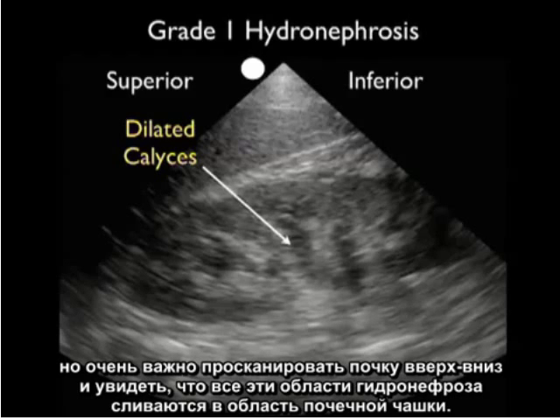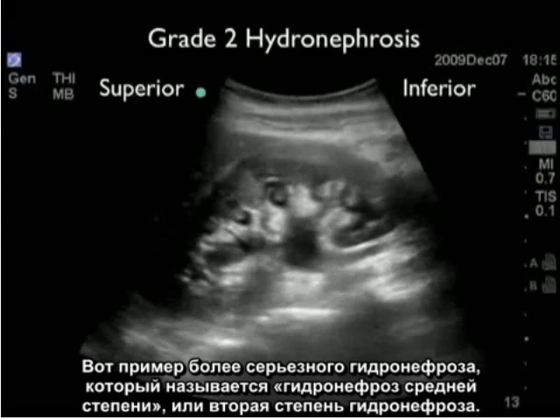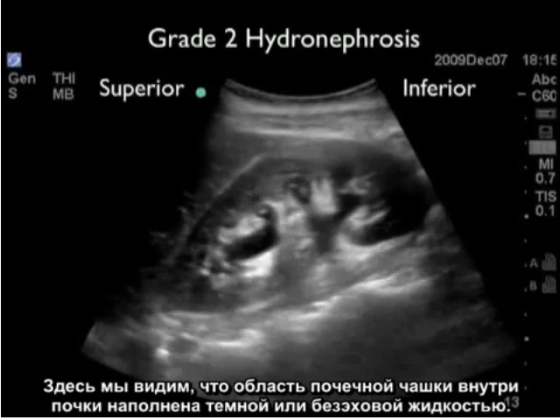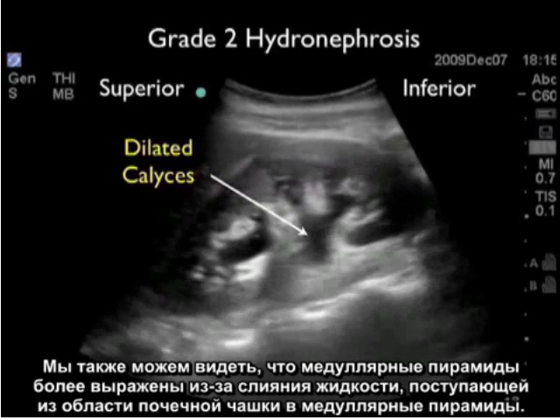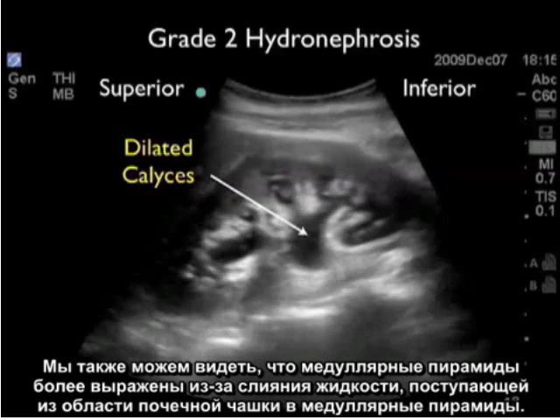Here's an example of a more advanced degree of hydronephrosis known as moderate or grade 2 hydronephrosis. And what we see here is that the interior of the kidney, the calyceal region, is filled with dark or anechoic fluid. We can also see that the medullary pyramids are more pronounced due to the coalescence of fluid going up from the calyceal region into the medullary pyramids.